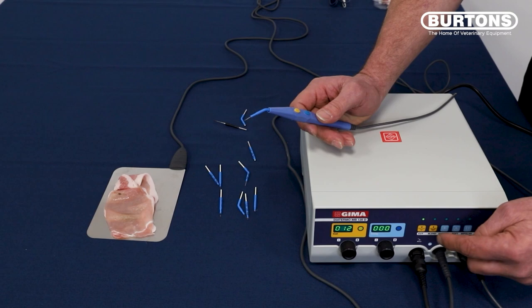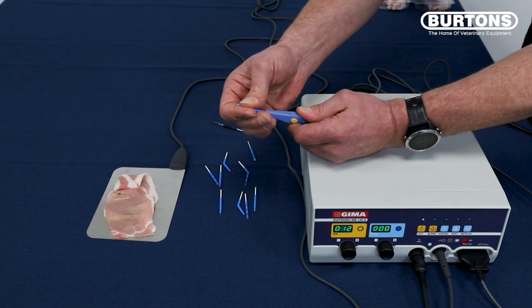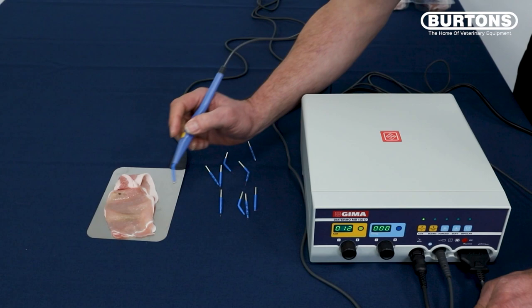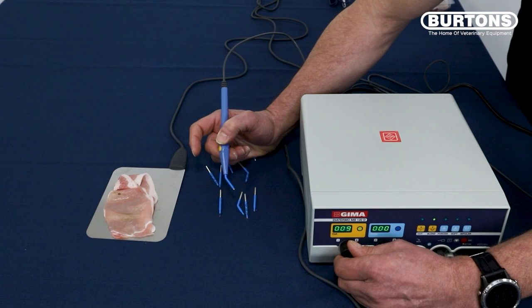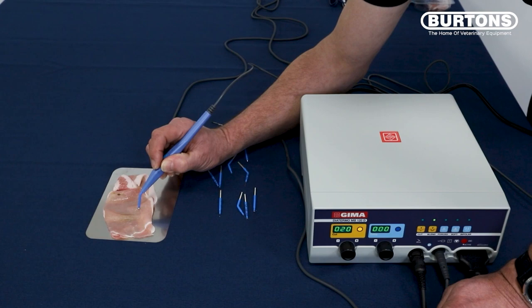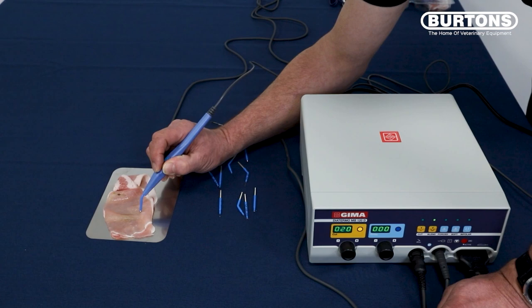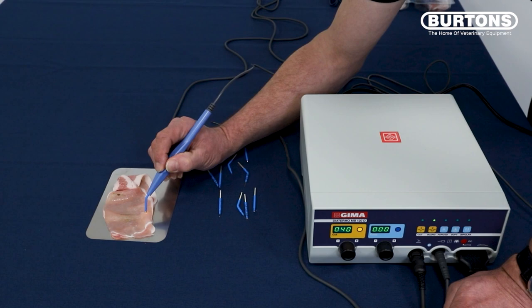Now we're just going to have a look at some of the other functions. We've been using the cut mode, but we're going to use the blend, which blends cut and cauterize at the same time. For that, I'm going to change the tip and put a ball tip on — handy for sealing fine bleeding vessels. Foot on the foot pedal. Once we change the mode, this resets back to zero, so we have to change the power back up again. Starting around 20, foot on the pedal, finger on the button — not making much of an impression. So we turn the power up to around 40, and you see the difference — now we're actually cauterizing and cutting at the same time.